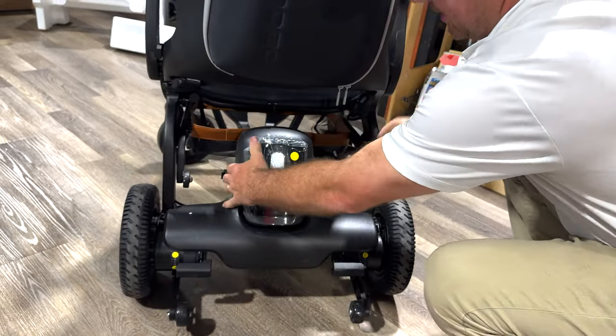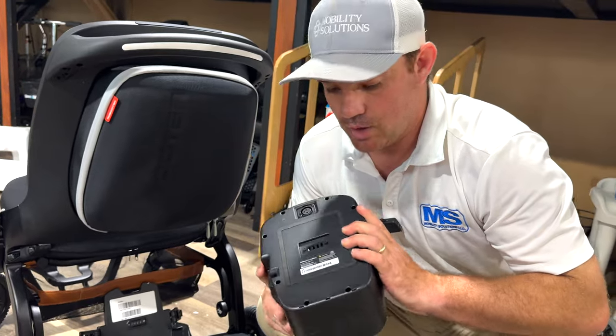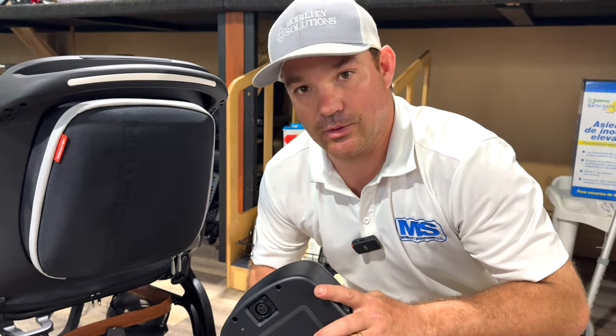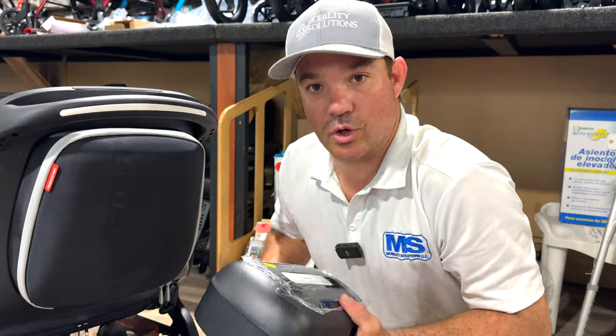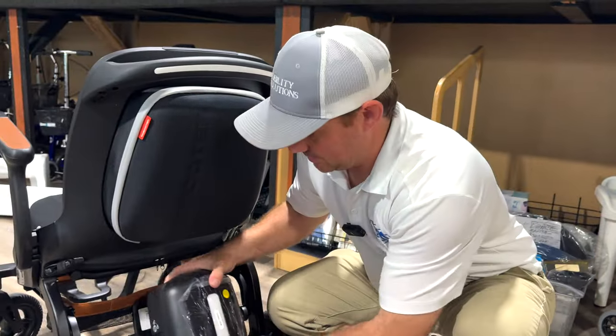Flip this back. This will be able to come out when you're traveling, or if you didn't want to take this unit inside your house, this can be removed. Now, if you're going to be taking this in your house, you don't need to do this, or if you're not really taking it, you're at an independent living, you can charge it through the charging port on the chair. But when you're ready to travel, to make it a little bit lighter, remove this battery. Put it back in, just take it right here.